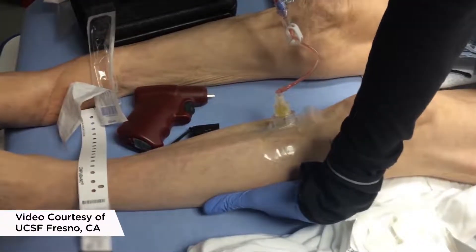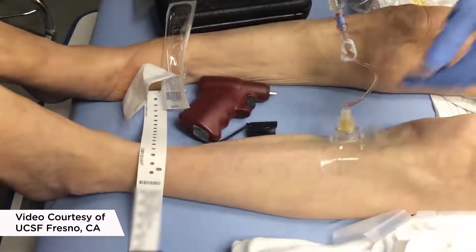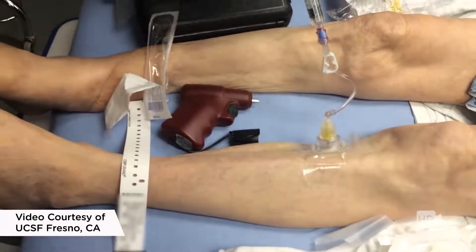That gives your patient 80 milligrams of lidocaine. Some people use a little more, a little less, but that's a safe amount. I also recommend anesthetizing the skin and periosteum before you start.